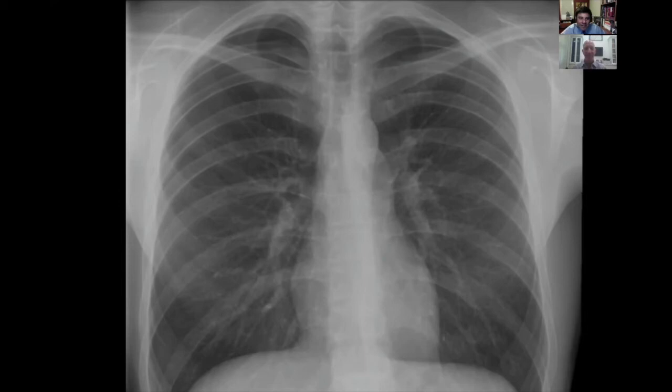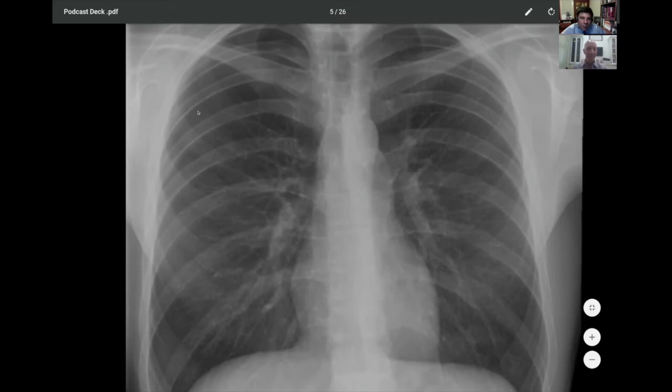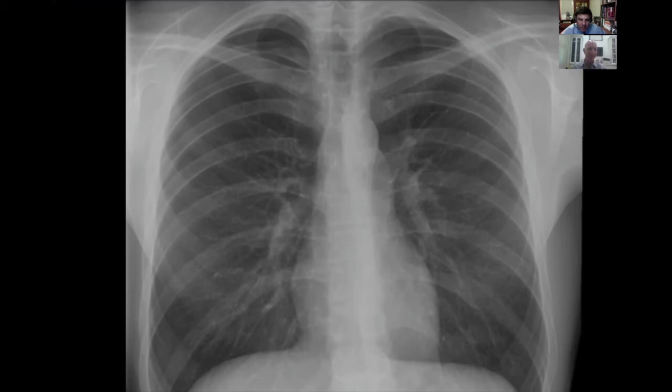And I think I can see it, tracing down from, it looks like there's a small size, yeah, right there. There's a small, or actually a moderate size pneumothorax, and you can actually see the lung margin as you go all the way down that lateral edge, down in the intercostal spaces down lower on the right side. I think you can see the edge going down that way, all the way laterally. So this is actually a not subtle pneumothorax. This is something that really anybody in the urgent care needs to look at this film and see. On first glance, it looks normal, but this is one that everybody needs to pick up.